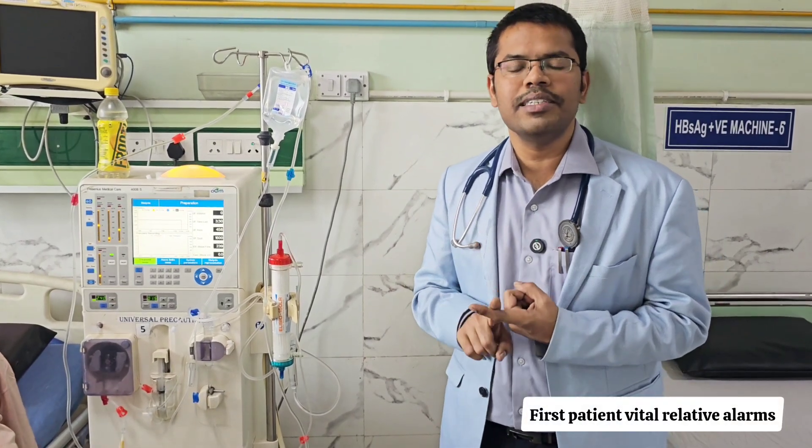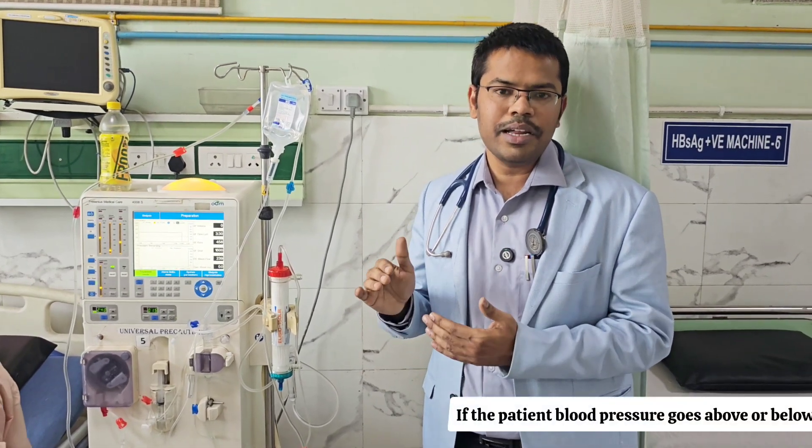First: patient vital-related alarms. In the monitor, if the BP is high or low, an alarm rings. Most units set the upper BP limit at 180 and lower at 90 — if the patient's blood pressure goes above or below that, the alarm rings. Similarly, pulse above 100 or below 60 will trigger a pulse alarm.